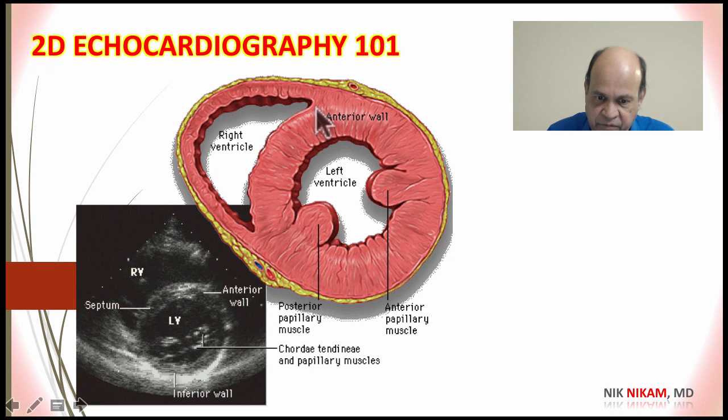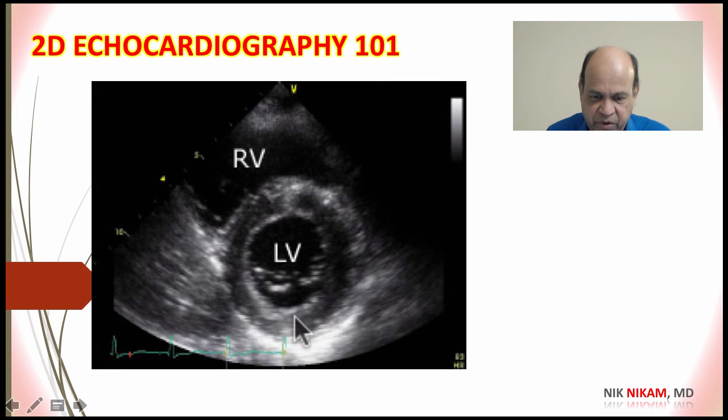Here we measure the left ventricular thickness, the septal thickness, and the posterior wall, and we can also measure the cavity dimensions at the papillary muscle level and calculate the left ventricular ejection fraction.